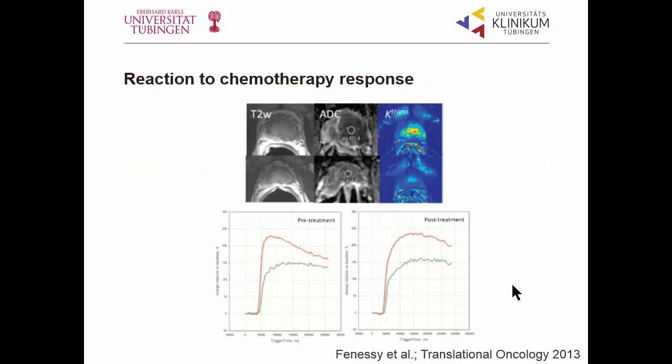Regarding response to chemotherapy, we can see that the type of the curve is changing after treatment. We can see that the downslope is not as profound after chemotherapy as pre-treatment, and so DCE MRI might also give us information on a response of prostate cancer towards chemotherapy.